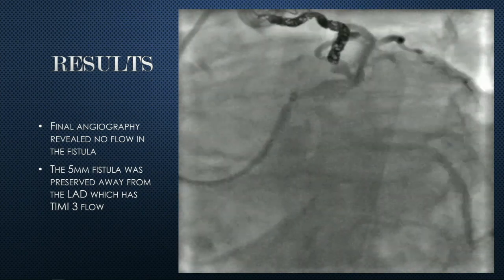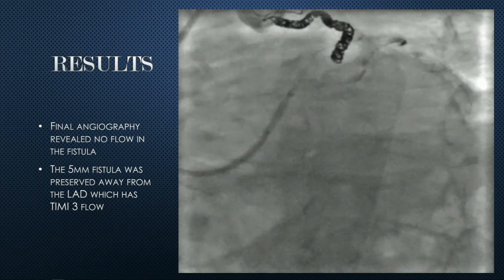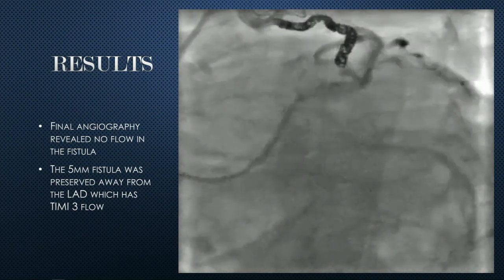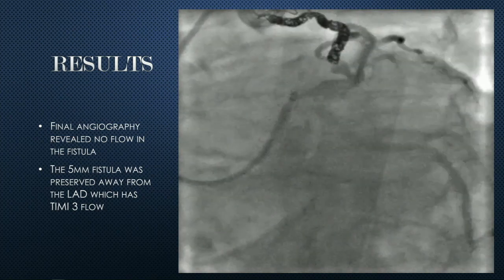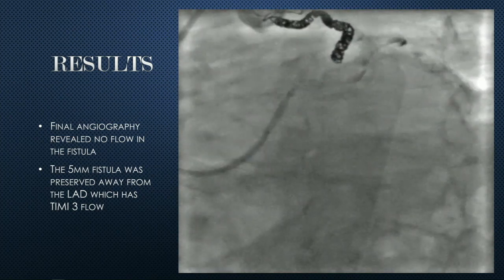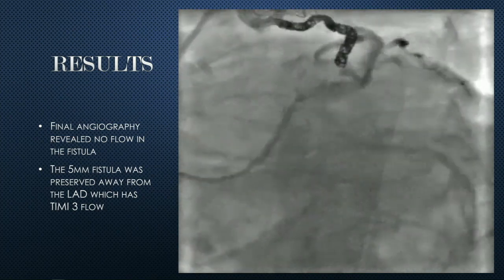Final angiography revealed no flow in the fistula. We continued to watch this for over 25 minutes to make sure that there was still no flow into the fistula and that the LAD continued to have TIMI 3 flow.